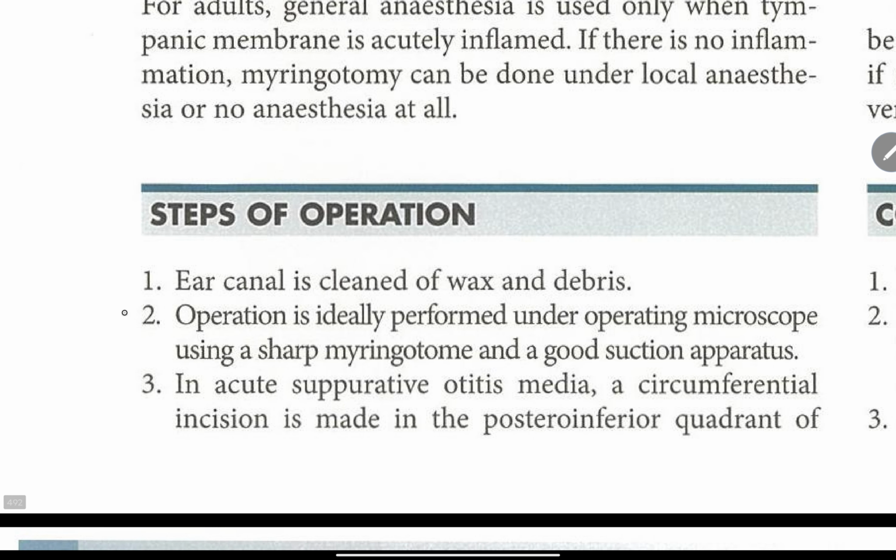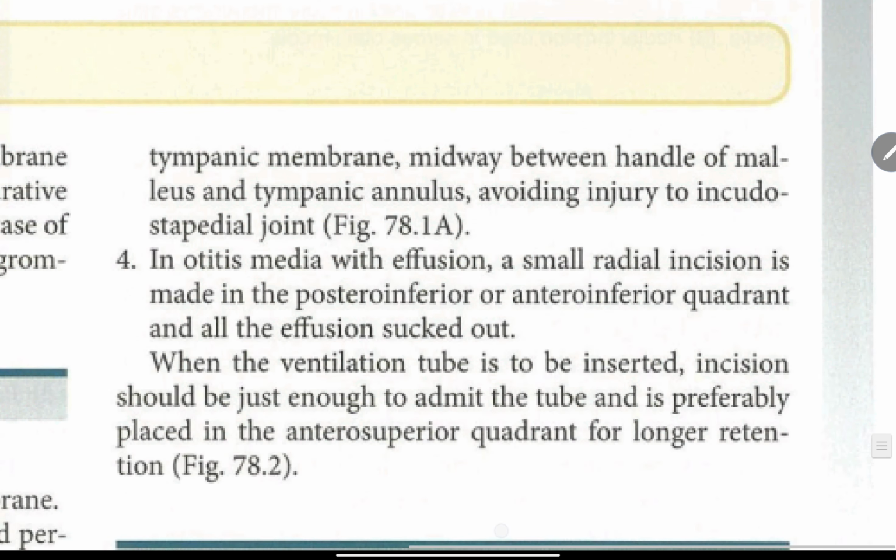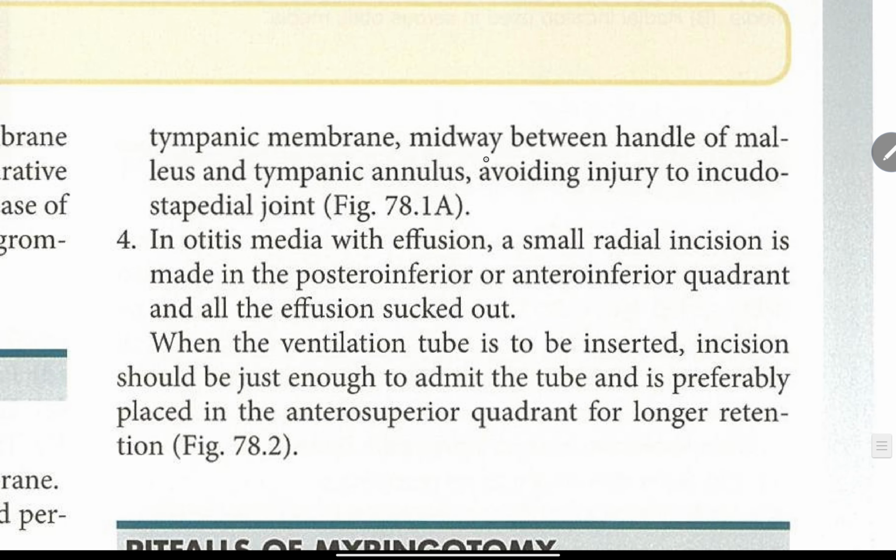Steps of operation. 1. Ear canal is cleaned of wax and debris. 2. Operation is ideally performed under operating microscope using a sharp myringotome and a good suction apparatus. 3. In acute suppurative otitis media, a circumferential incision is made in the posterior inferior quadrant of the tympanic membrane, midway between the handle of malleus and tympanic annulus, avoiding injury to incudostapedial joint.